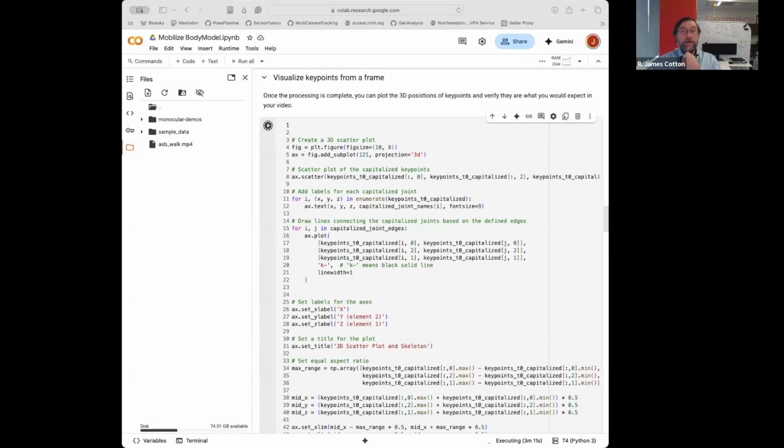Oh, drawbacks of monocular versus multi-view. So I think the main difference here is usability, right? A single camera is much more usable, not as accurate. But as we're showing, it's accurate within a couple of degrees, and so for a lot of clinical applications, it's more than sufficiently useful. But even for some clinical questions, multi-camera markerless motion capture is not accurate enough, right?